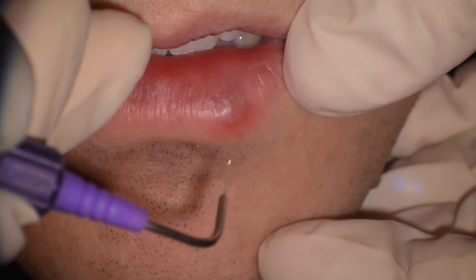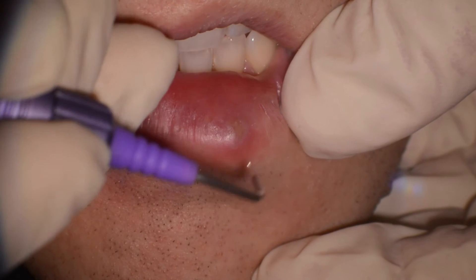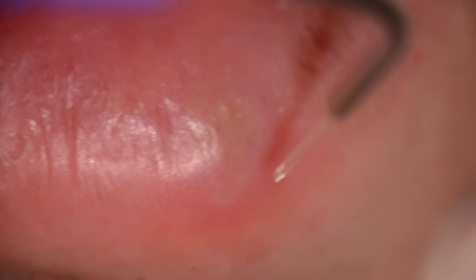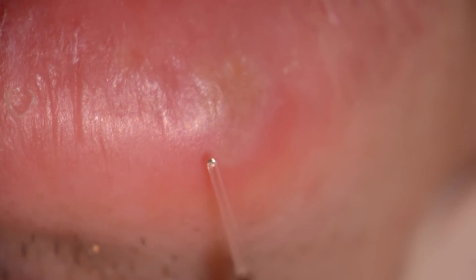All right, this is 0.6 watts — and if you feel something, just put your hand up. You feel that? 0.6 watts for 45 seconds, and 0.8 watts for 45.